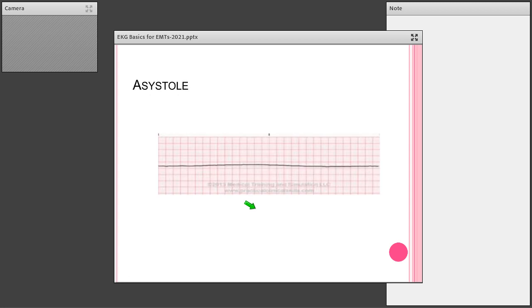And then finally, the worst of all is asystole or flatline. Unlike TV, you cannot shock this, because we all know that the AED essentially stops your heart. It recognizes, like in VFib, that erratic electrical activity and it says, stop it. The electricity, the shock stops it so the heart can start up again in its good rhythm. With asystole, the heart is already stopped, so you can't stop it more or make it more stopped. There's nothing that the AED can do for this person.